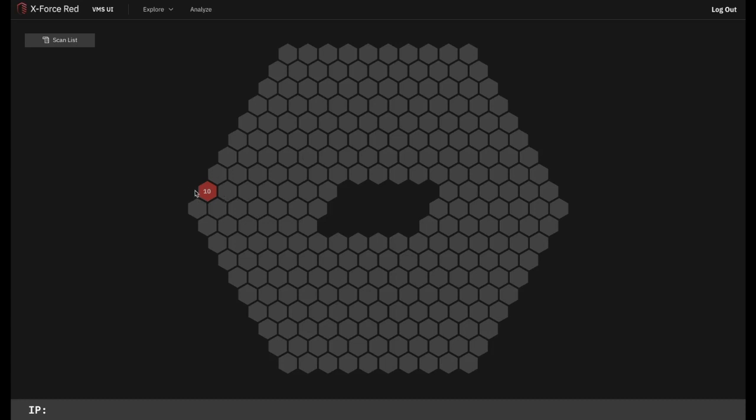In this example, we have a 10.x network representing a single hospital. If a health system has multiple hospitals within it, then other hexes will light up to represent each of these.